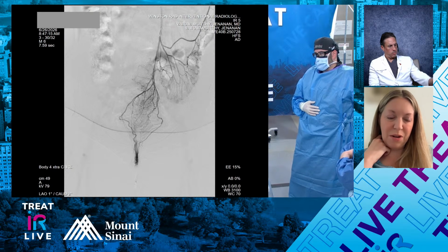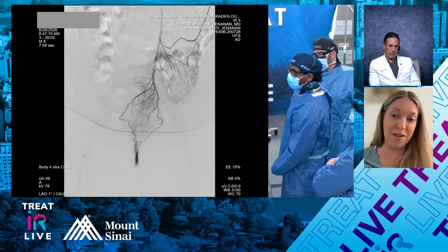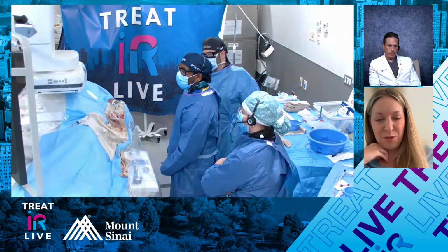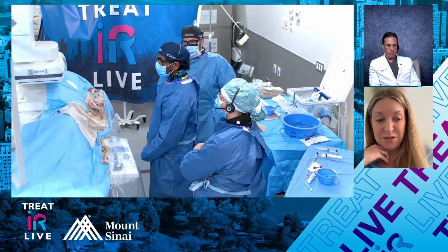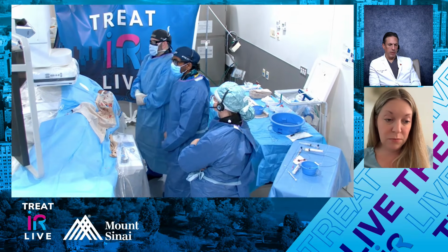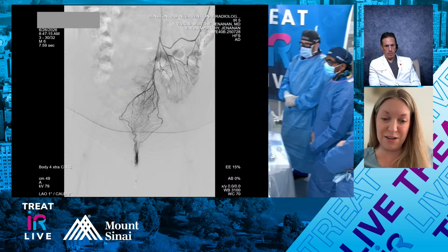Yeah, I agree. We don't want permanent distal occlusion like that. We need these collaterals to keep this area alive. We do not want it down to the capillary level with a liquid. So I would say we need to define better what micron level we need this to stop, and see if that can be reliably obtained with a liquid. Now that you've seen the pre with that nice blush, we're not leaving that occlusion anymore. I think you nailed it.